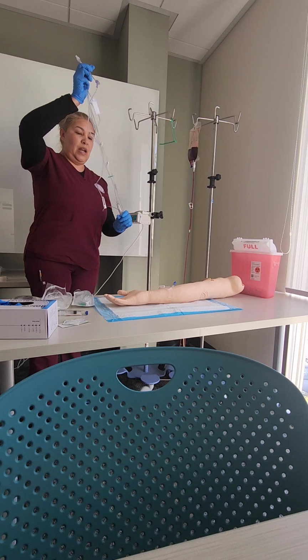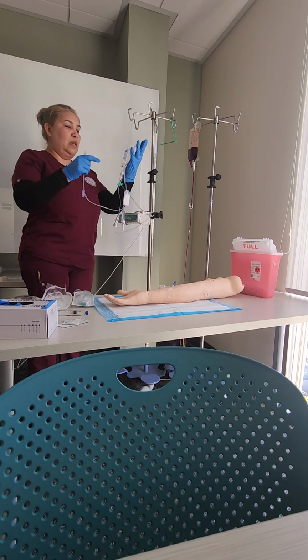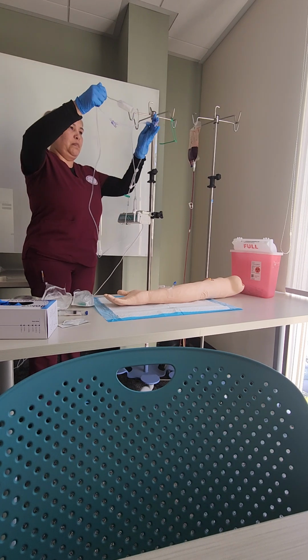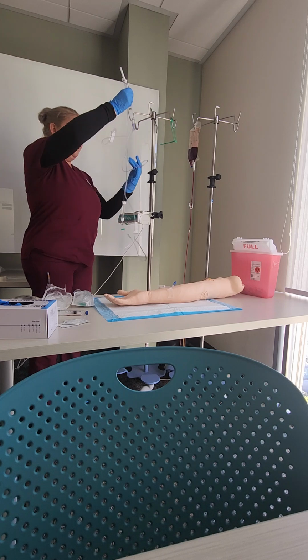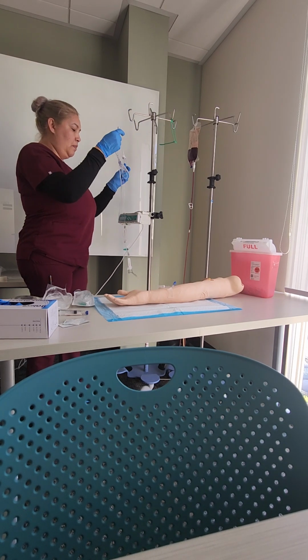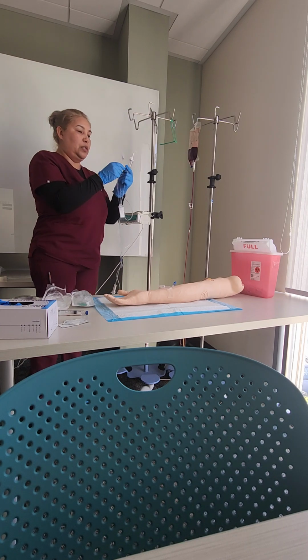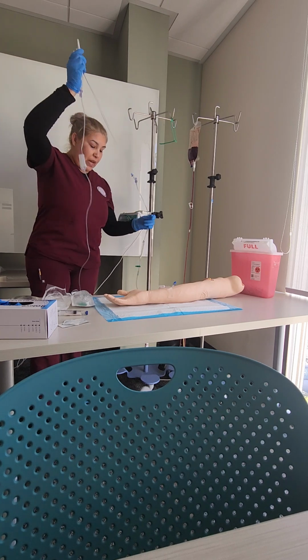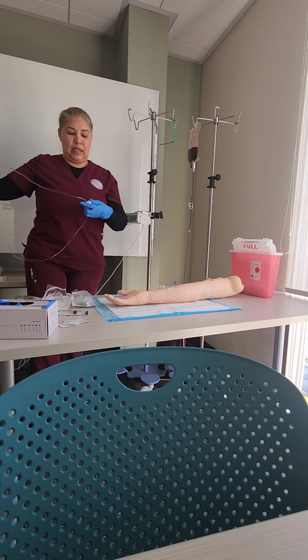I want to make sure that I inspect my IV tubing and that there are no kinks, nothing is broken, nothing is ripped. It's a little tangled, but I will go ahead and untangle it. Perfect. I want to make sure that I maintain sterility and not touch or open anything until I am fully ready. What I want to do is make sure that my tubing is clamped.